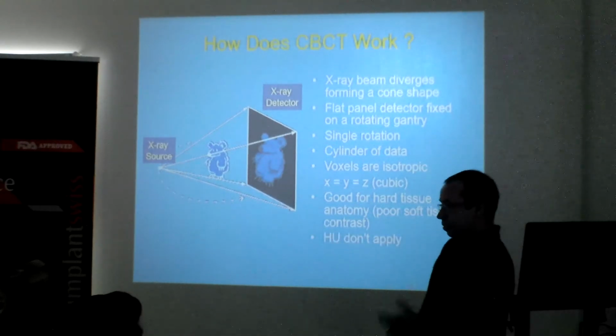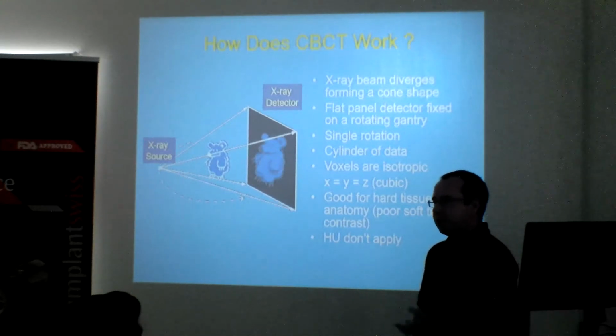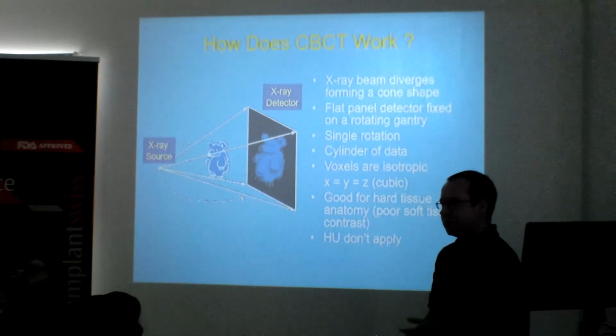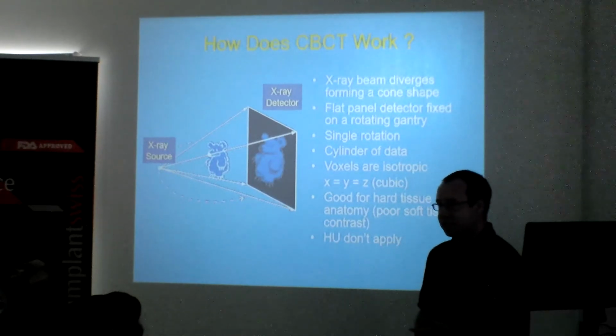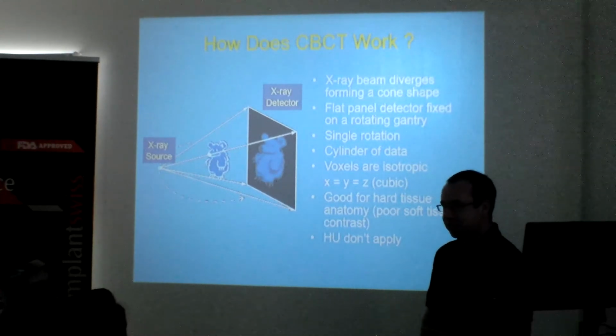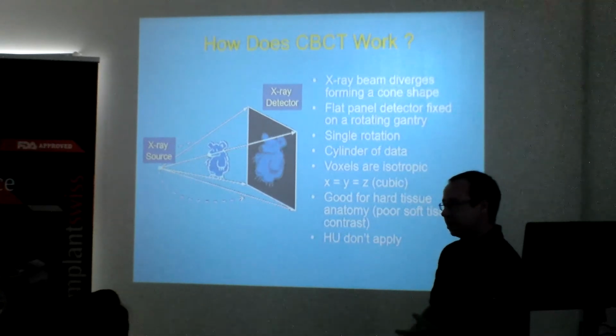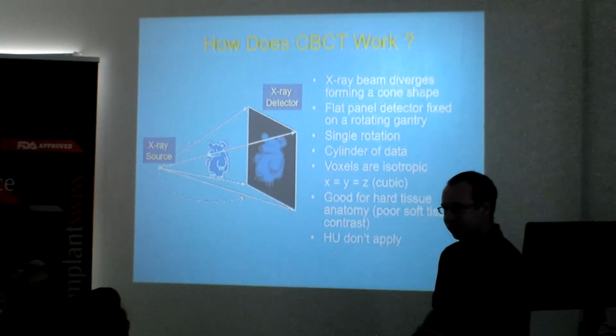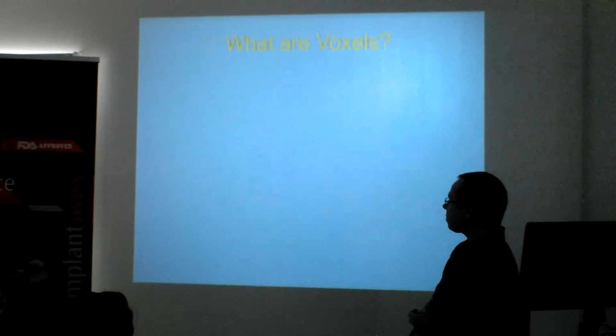And the other important thing with cone beam CT is you've probably heard the word Hounsfield units before. Hounsfield units don't apply to cone beam CT. Some software, like the iCAD Vision, does have an availability in there to do HU statistics, but it's not a reliable way of measuring bone density. The only proper way with cone beam CT is visual, and that's always best done in a dark room. So how the radiologists sit, tucked away in their rooms with all the lights off, that's the best way to view an X-ray image. You get a lot of information that way.